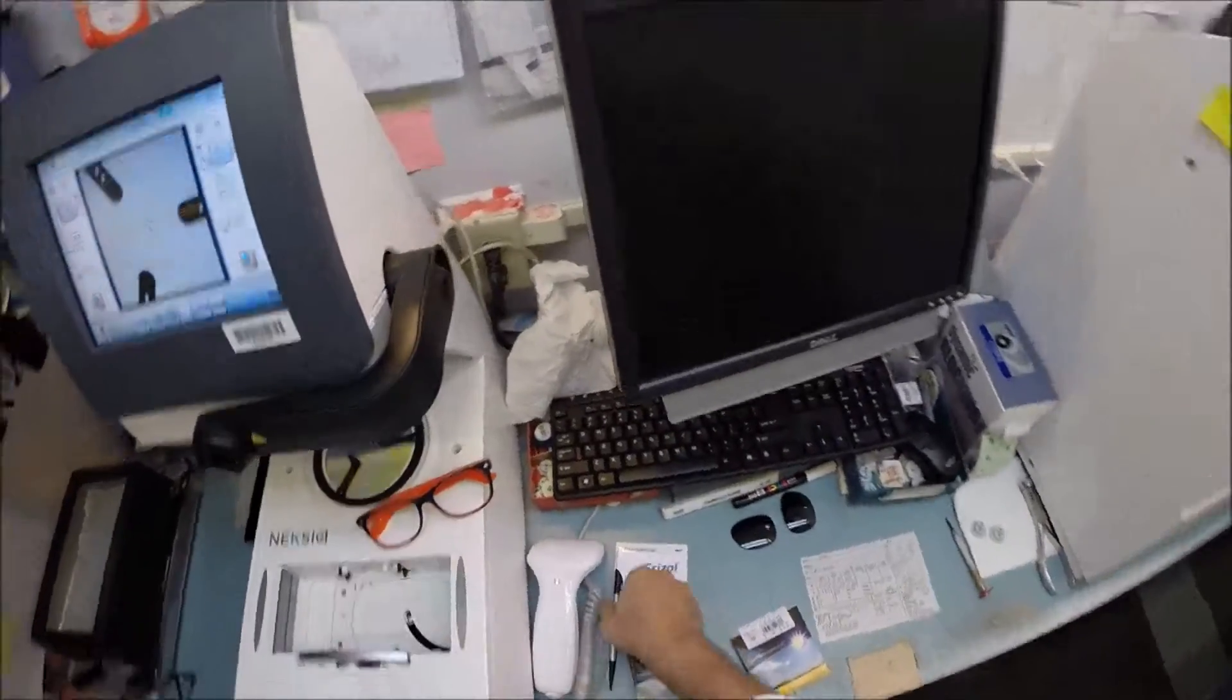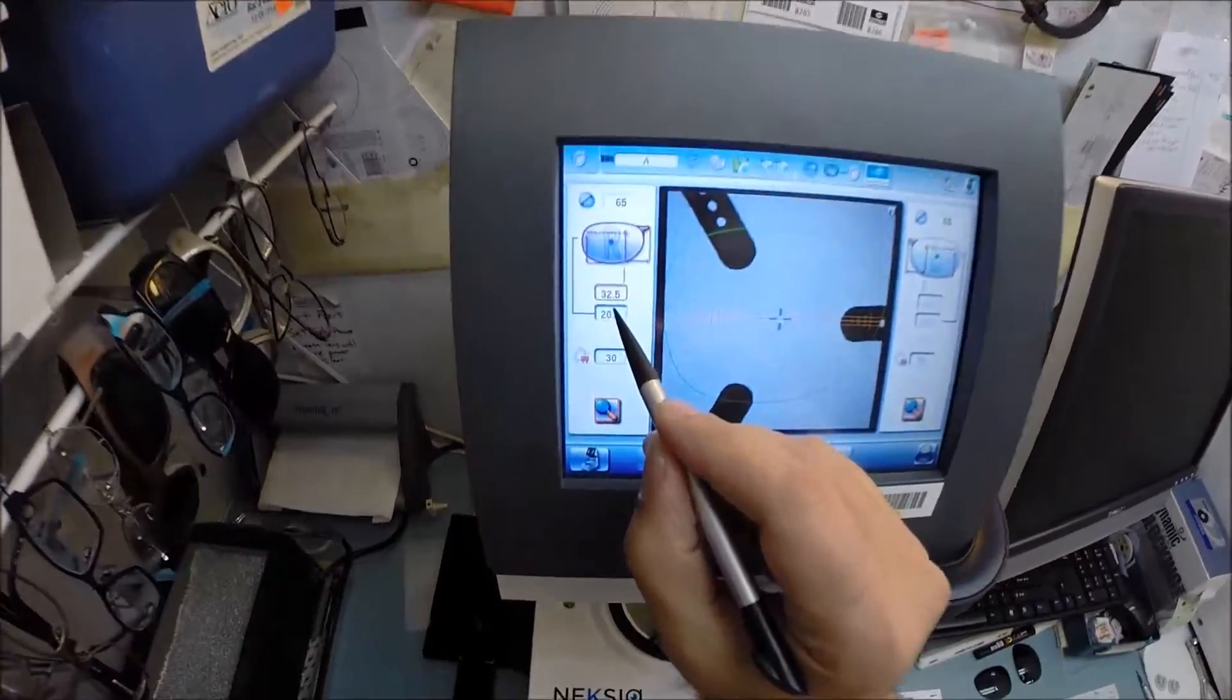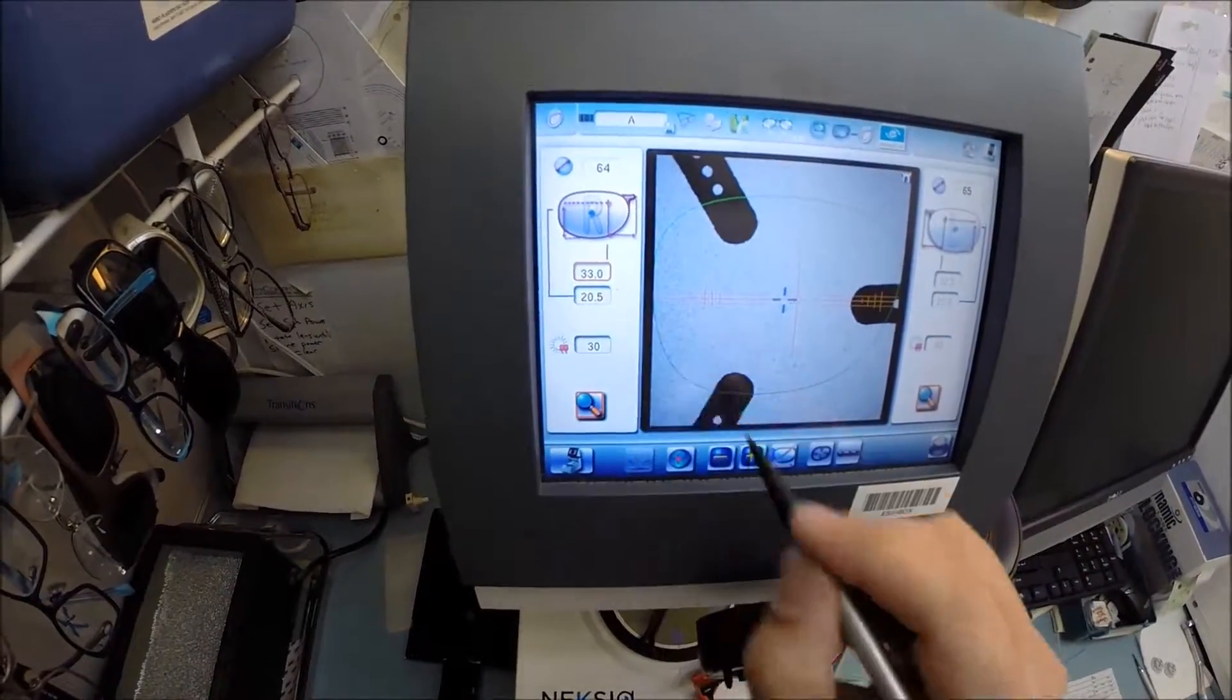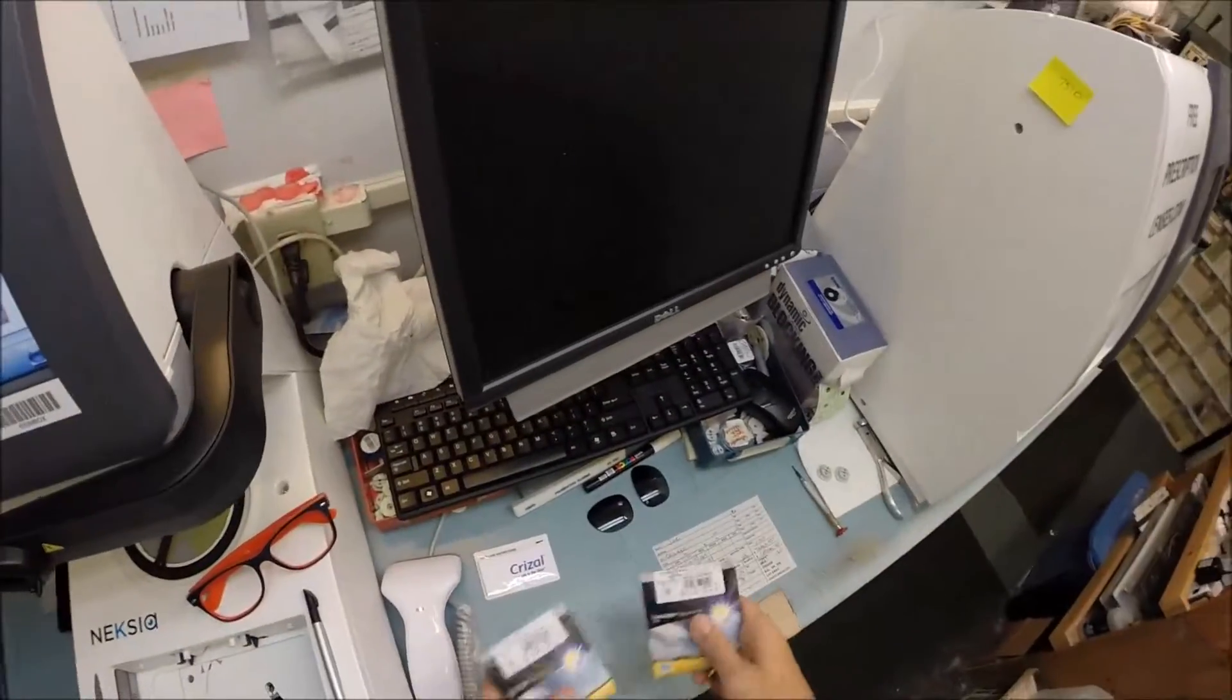Let's go ahead and get the pupillary distance set. Yours is 33.5 in both eyes. It automatically starts at 32.5, so I'm going to hit this plus button until that number gets up to 33.5. We are good to go.